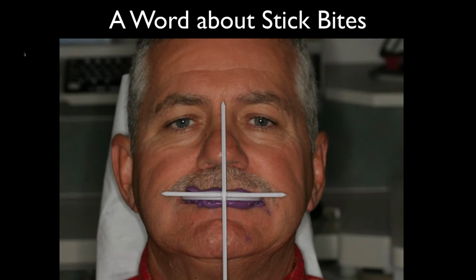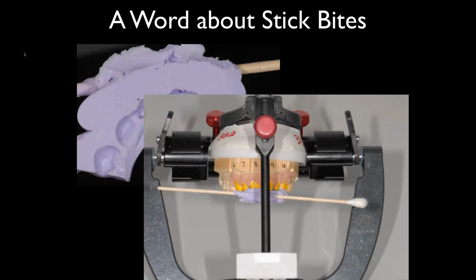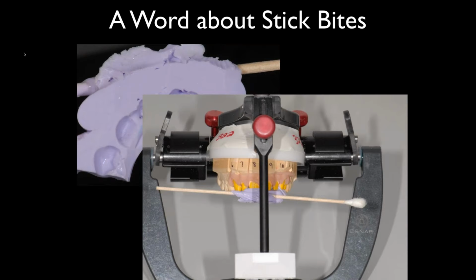And the problem is the fact that it's taken as a bite. And here's what I mean. When I get a stick bite, and they're almost always taken as a bite, they have indentations from both the mandibular and maxillary teeth in them. They fit in between the two. The only time I can use it is after I have mounted the case, and then I can stick it on, and the best thing they do for me is tell me that I'm wrong. Man, this mounting's off, and now what? Now I need to knock this model off and try to compensate and try to guess. We've got to tilt a little more to the left here, bring that side down, bring the other side up and remount it, and then it's off a little bit the other way. We've all been through it.